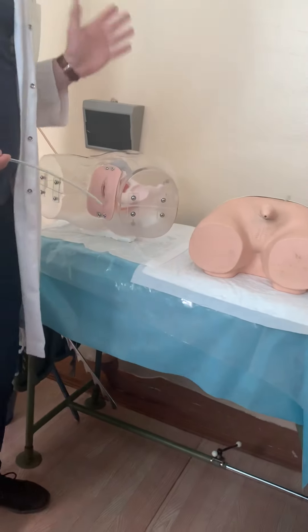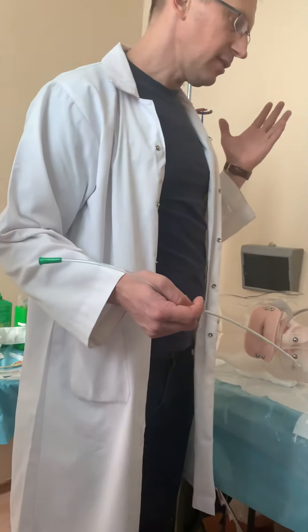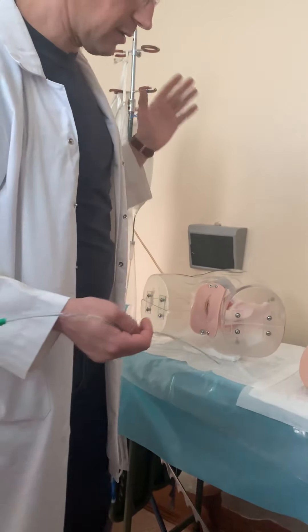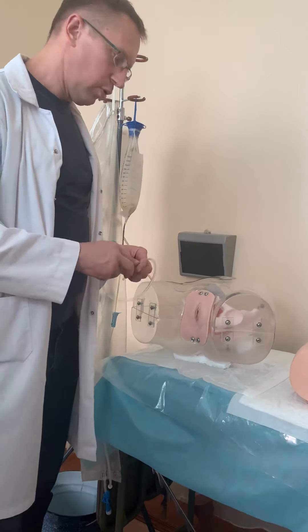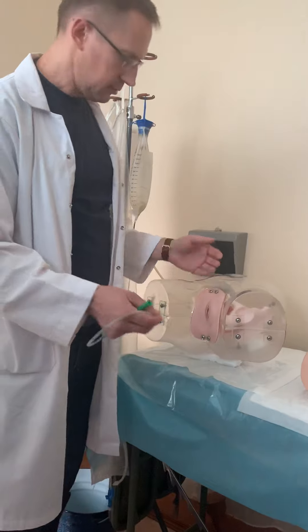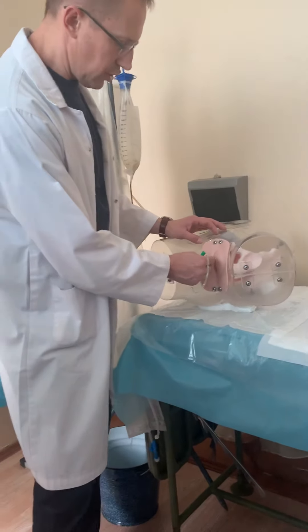Also, you must communicate with the patient first — that is very important. You must present yourself and explain the aim of the procedure and possible complications. For a female patient, it is the same procedure, only with a shorter catheter. Insert the catheter until urine comes out.